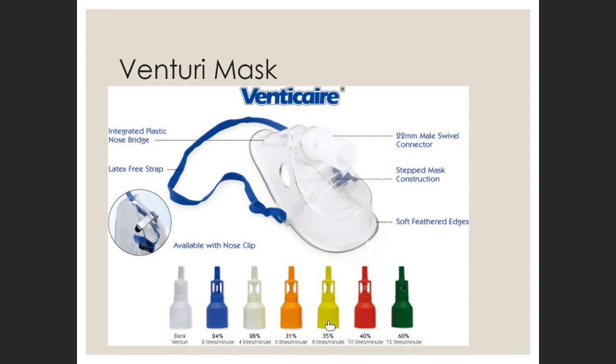So this is the Venturi. It's a fixed performance device, and that's because of what I call the Venturi principle. And you'd have heard it or will hear it when it comes to asthma and COPD, you'll do it again, you may have done it in ABGs, RMI Wednesday, and so on. So this is a repetitive thing. You have to learn. So everybody's homework today is to go learn the Bernoulli principle and the Venturi effects.